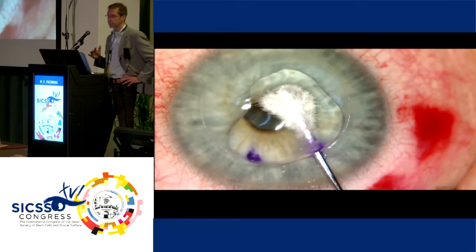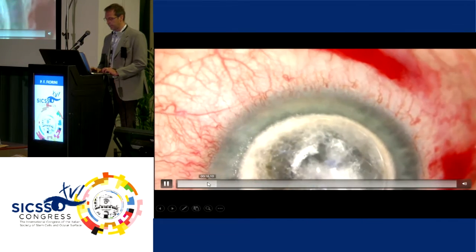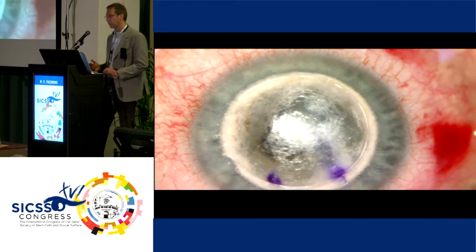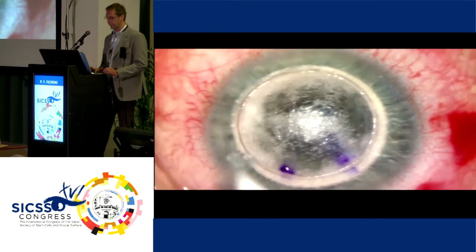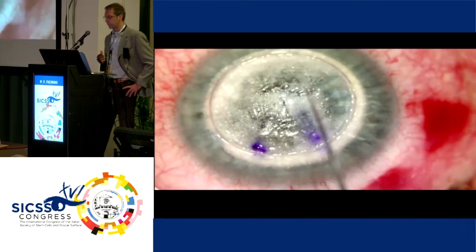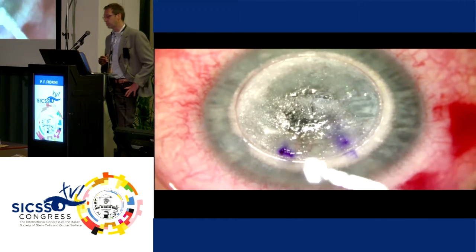But the point is, we start from very deep inside, and so this technique brings you very easily very close to the deepest stroma layers, in order to create a Descemet bubble. Then you get out, and here the technique is exactly the same. This morning I replaced my video because it was suggested that it is extremely important to apply some viscoelastic before cutting. This is an old video, so I didn't put the viscoelastic. I wanted to highlight how important it is to apply viscoelastic on the cornea before opening it.